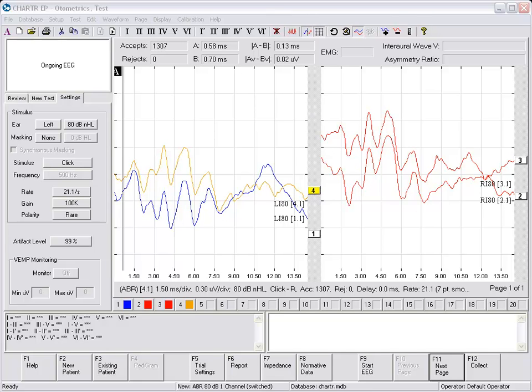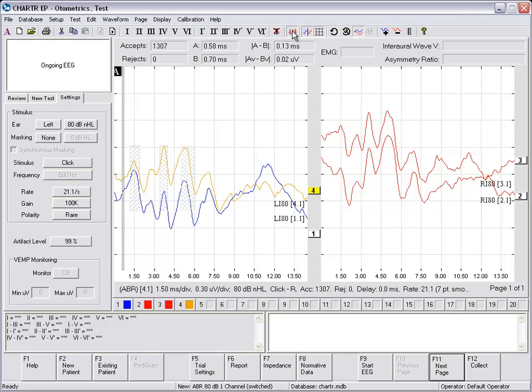You may choose to use the Shaded Normative Data feature. This feature will place shaded areas on the highlighted waveforms and assist you in marking the waveforms appropriately. This uses age-matched normative data built into the system.